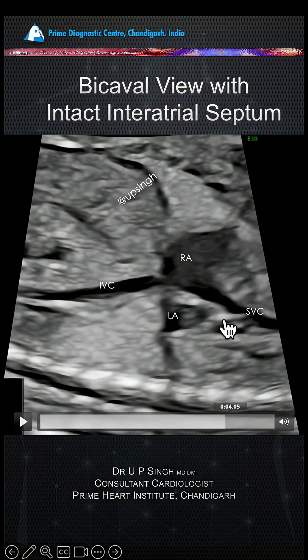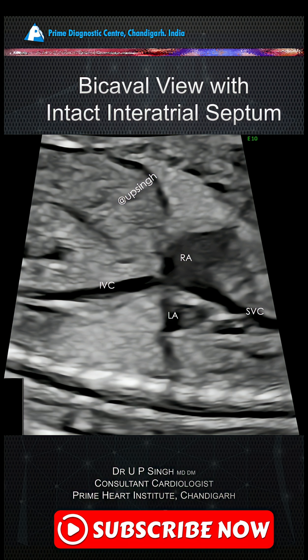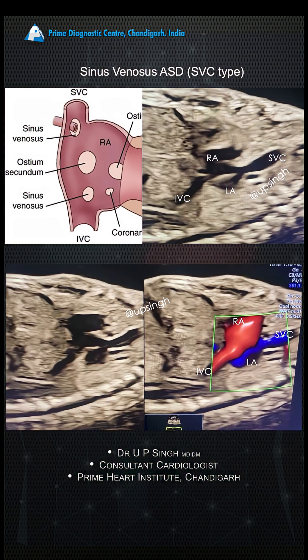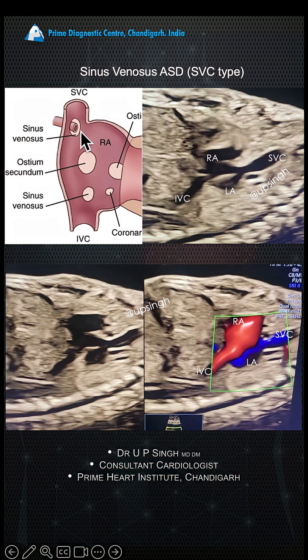This is where the portion of sinus venosus type of ASD would happen. Now let me show you the case. Normally the sinus venosus ASD is somewhere here, close to the upper pulmonary venous insertion — that is where the SVC enters into the right atrium.